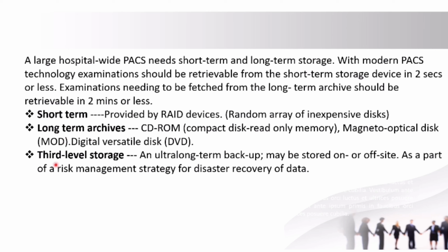Now the third level is for emergency or risk management conditions. We have a third level of storage, that is an ultra long-term backup, which may be stored on or off site as part of a risk management strategy for disaster recovery of the data.